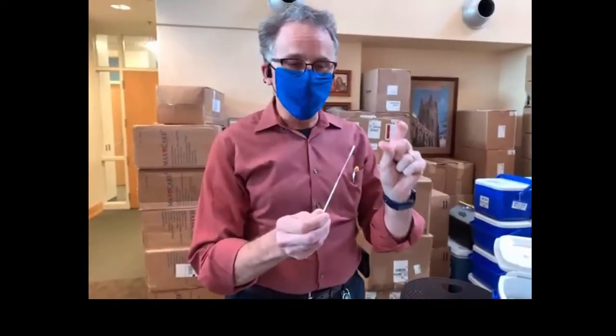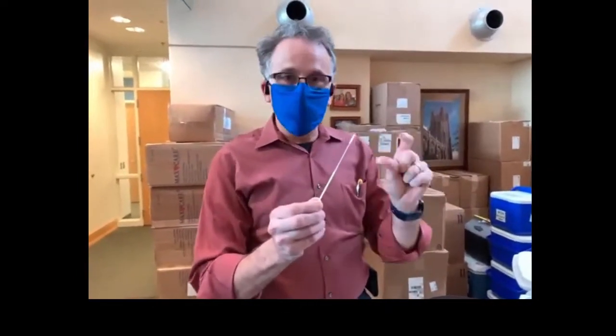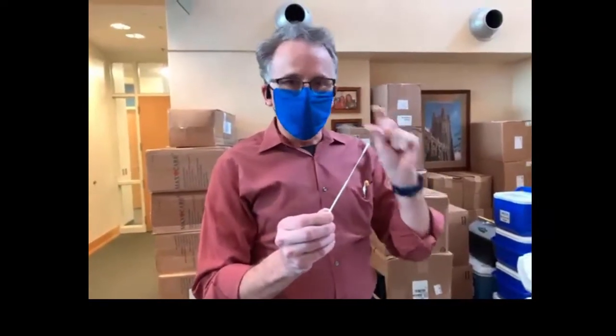Now it will tickle a little bit. I actually practiced this on myself about half an hour ago just to make sure I got it right, and it will tickle a little bit — it may make them feel like they need to sneeze. But if they're doing that, then they've done it correctly.